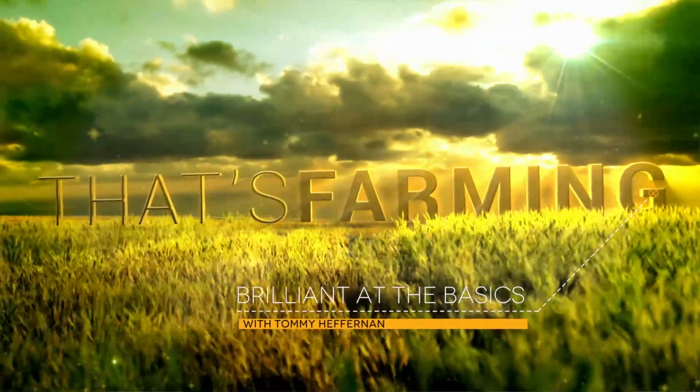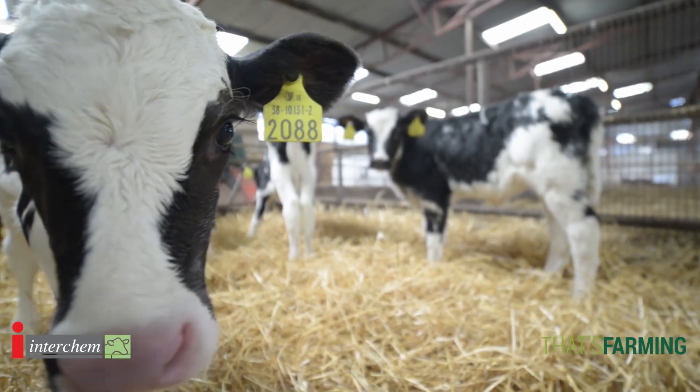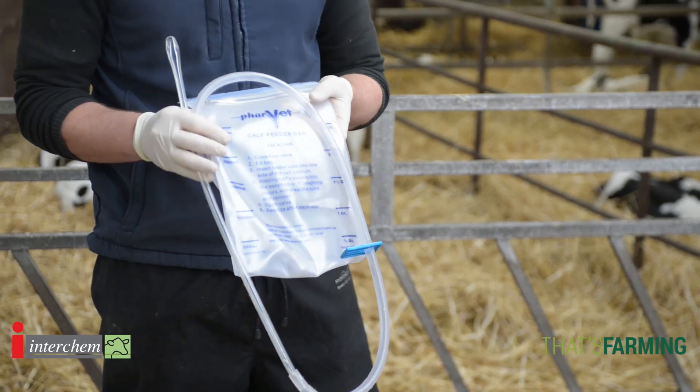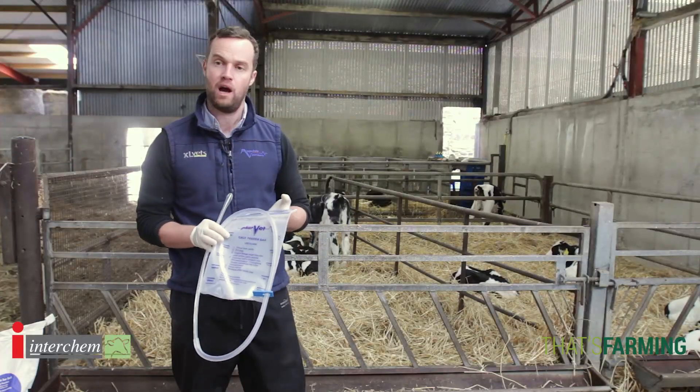Hello and welcome to our series on being brilliant at the basics. My name is Tommy Heffernan, I'm a vet in Wicklow and today we're going to talk about stomach tubing the calf. Stomach tube is a fantastic tool but often what we find with stomach tubing is people are sort of afraid of using them. What we want to do in this video is create confidence around its use and how to use it.